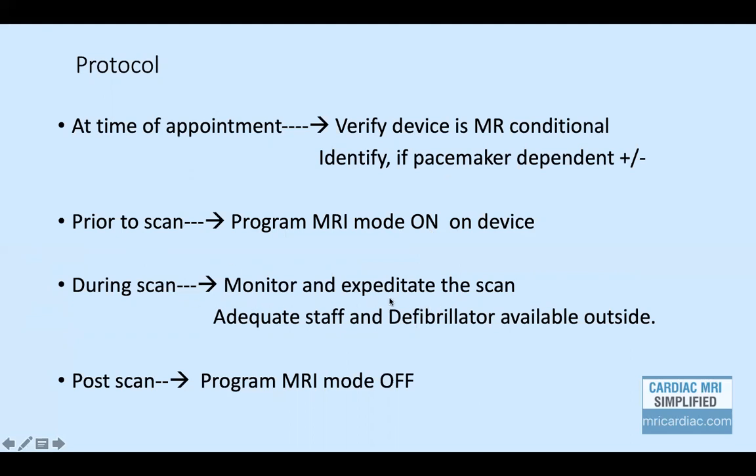Do not take any extra sequences. Make sure that you have adequate staff and defibrillator devices, etc., available outside. And immediately after the scan, the programming has to be done and the MRI mode has to be switched off.